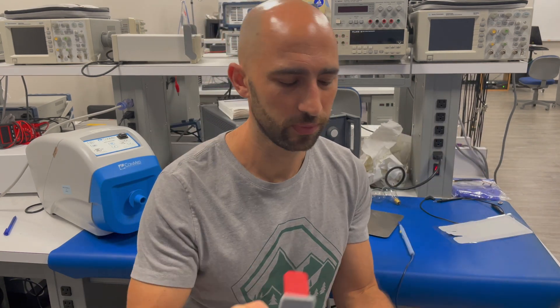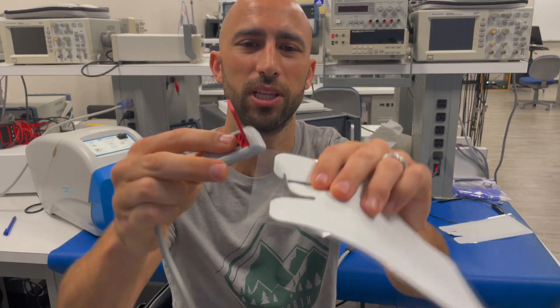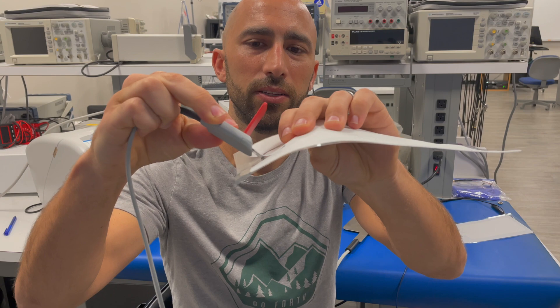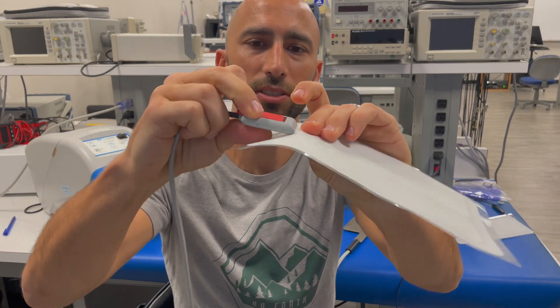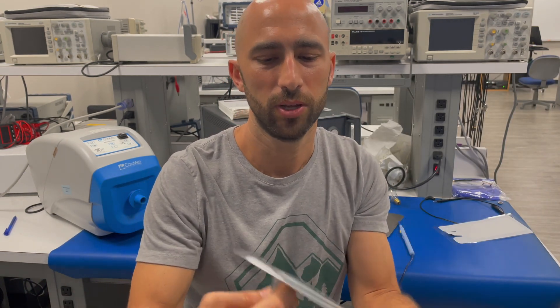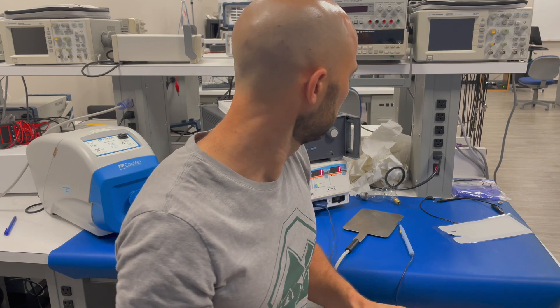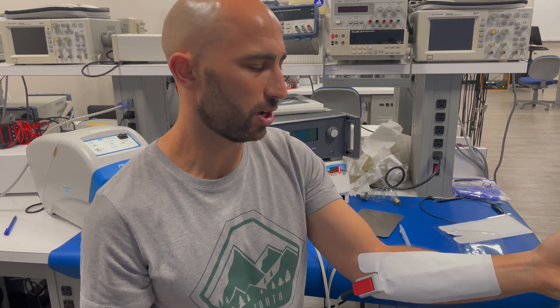To attach one of these electrodes to the lead, you have to open it up and then slide the electrode in. Make sure it's nice and snug. At that point you can pull it off and place it on the patient — I suppose I'm going to have to be the patient since I don't have any others around. So you can see that's on my arm.